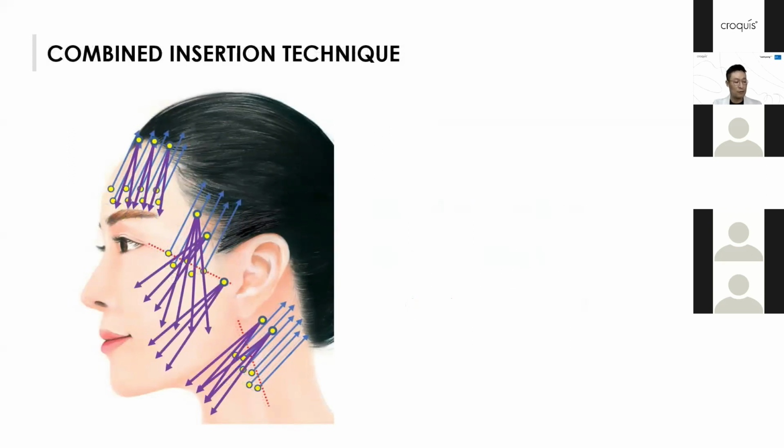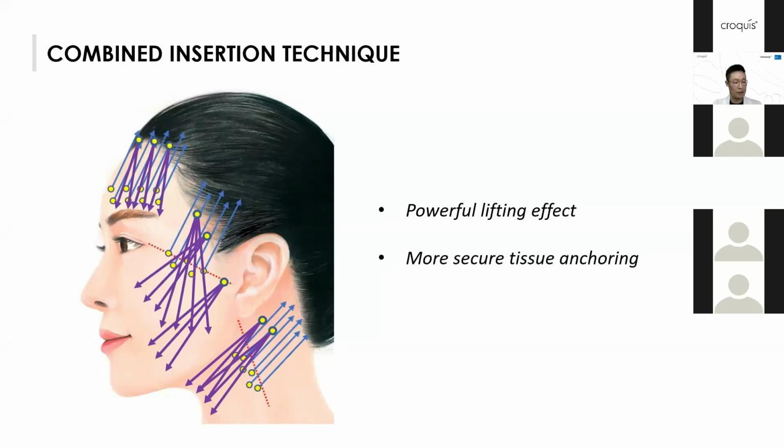When combining these two methods at the same time, a much more powerful lifting effect can be achieved by the enlarged skin surface for anchoring the tissue by the cogs. However, a longer downtime may be required.